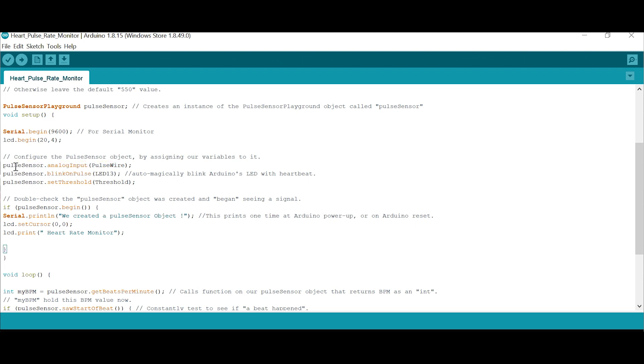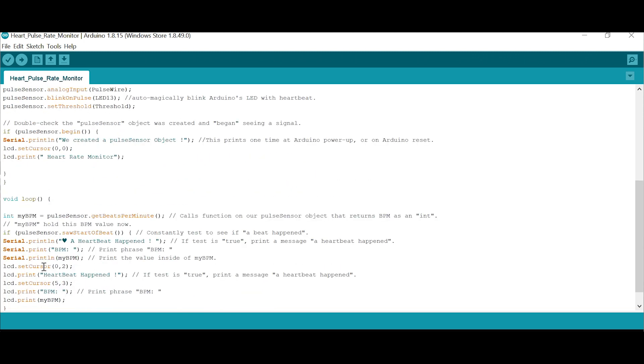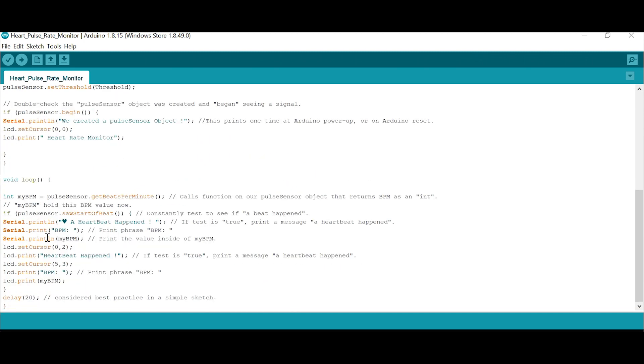Pulse sensor - this is analog sensor, analog input pulse wire. Pulse sensor blink the pulse. Set threshold - it receives the analog input and checks with the threshold level, compare, and display. The baud rate is 9600. Serial printed the pulse sensor output. That's a heart rate monitor.